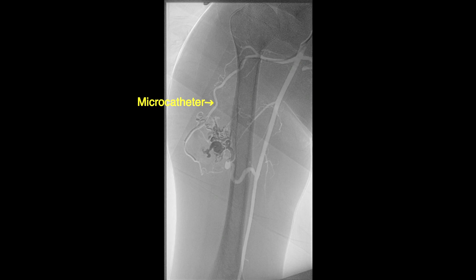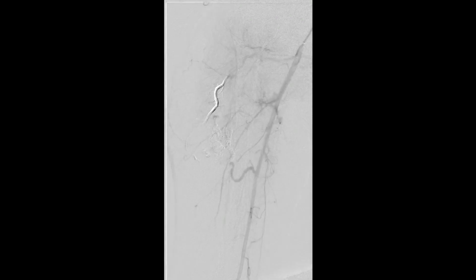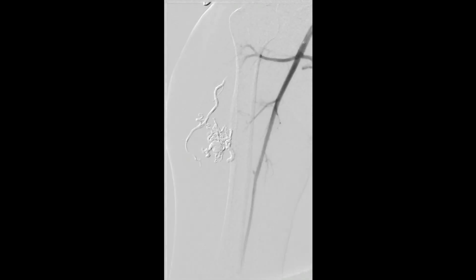This was followed by injection of onyx into this branch, completing our onyx embolization of this branch of the axillary artery. A completion angiogram was then performed that showed no flow into the AV malformation.